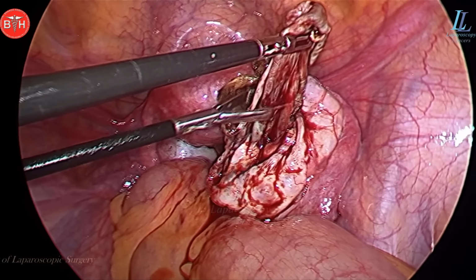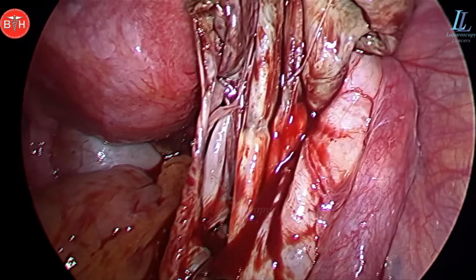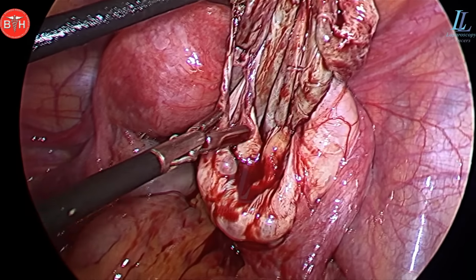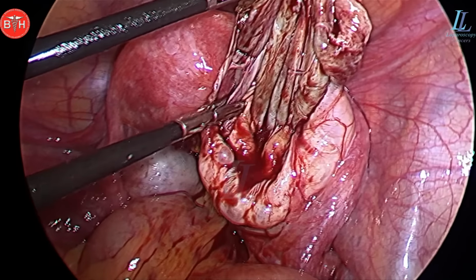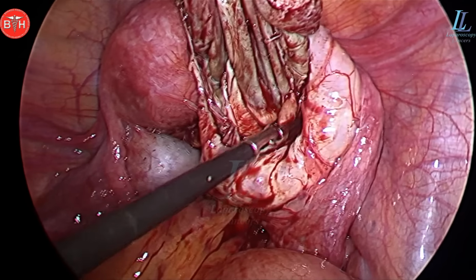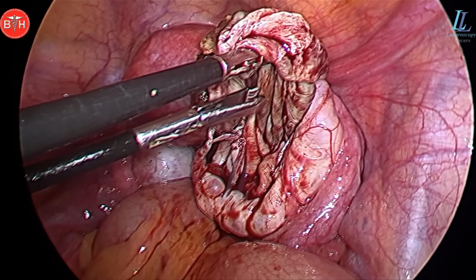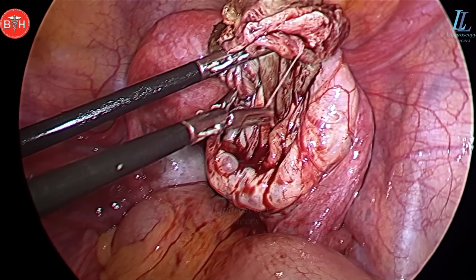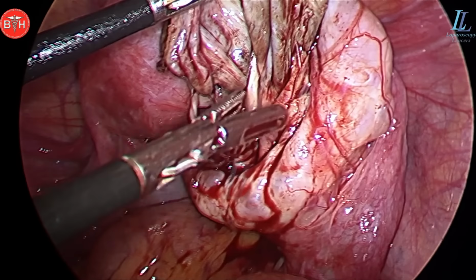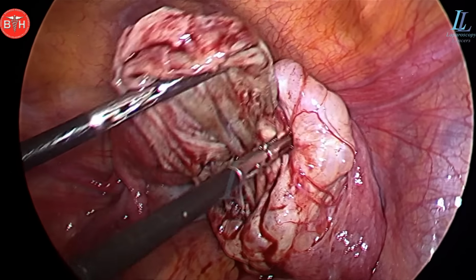So there you can see I am trying to pull out the chocolate cyst, and look how easily it is coming out. Not easily though, as it has marinated the cyst inside. There is quite a lot of adhesions, and I am using quite a bit of force to pull it out. And don't worry about the bleeding. If the planes you are following are correct, as you can see over there, bleeding will be almost nil to minimal. So no issues. Just improve your skills, hold the tissues nicely and tightly.